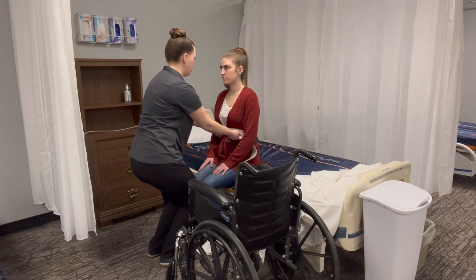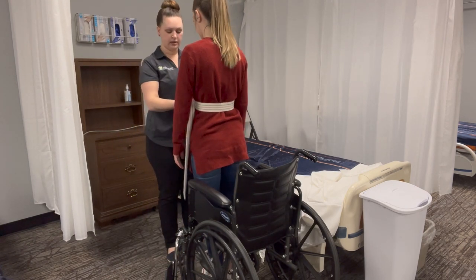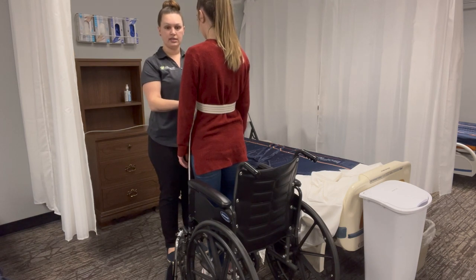One, two, three. She's going to back up until her legs are touching the wheelchair, and we're going to instruct her on the count of three to sit down.